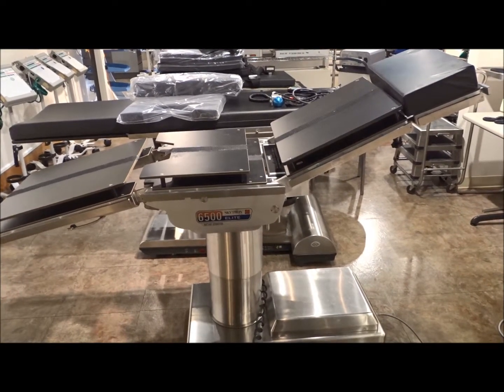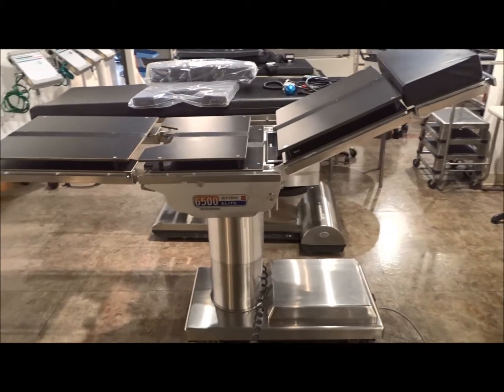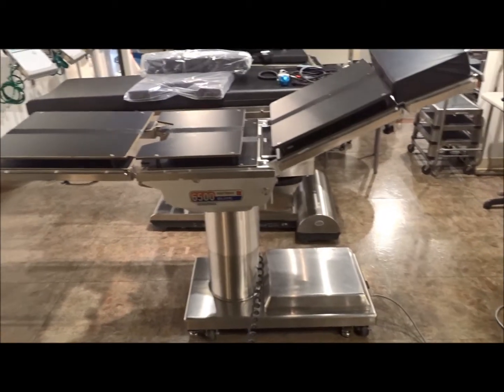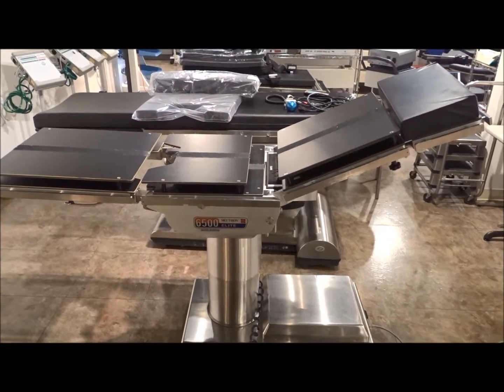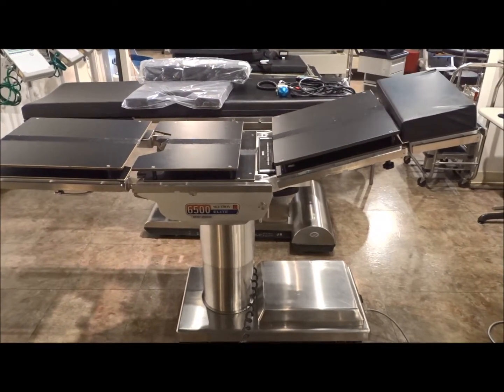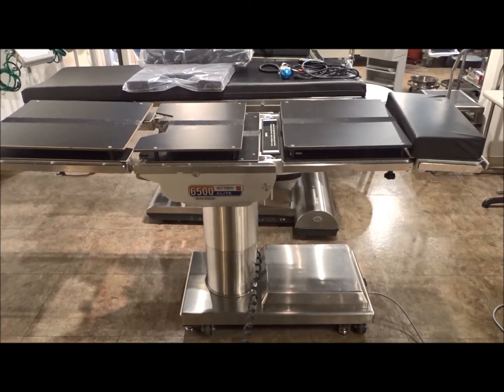We carry orthopedic equipment, surgical lights, and anesthesia — give us a call. Hospital Direct Medical, iMedical, San Diego, California, and Richmond, Virginia. We can give you more information, pricing, and arrange to have this table shipped anywhere in the United States and anywhere in the world. Once again, this is the Skytron 6500 Elite.